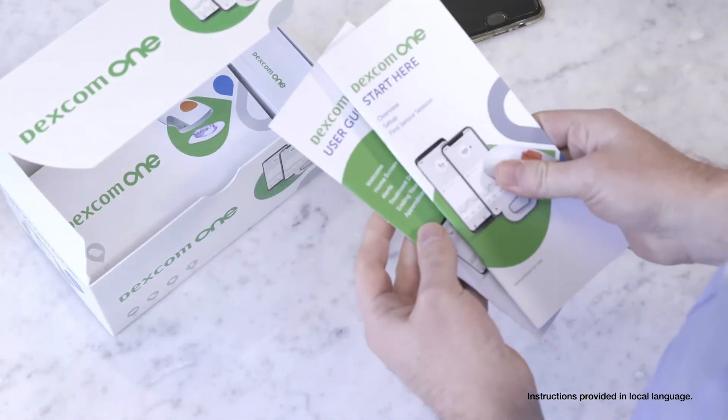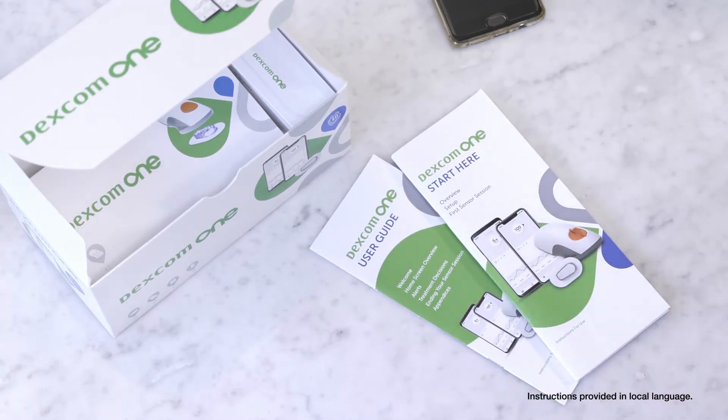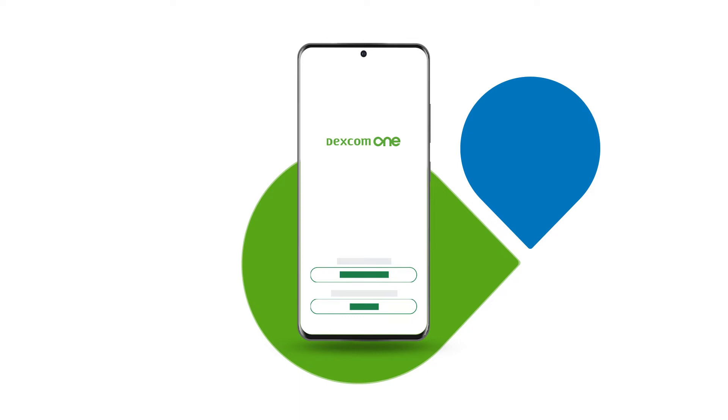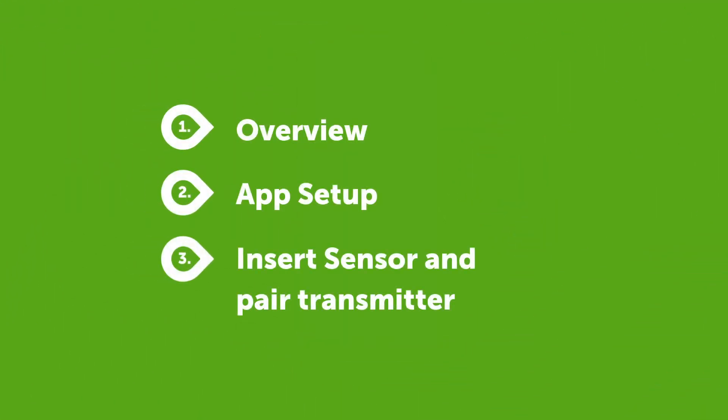The Dexcom One box contains a sensor, transmitter and your instructions for use. The first thing you need to do is download the Dexcom One app. Then either log in, or if you have never had an account with Dexcom One, create an account first. The app walks you through the entire setup process step by step.